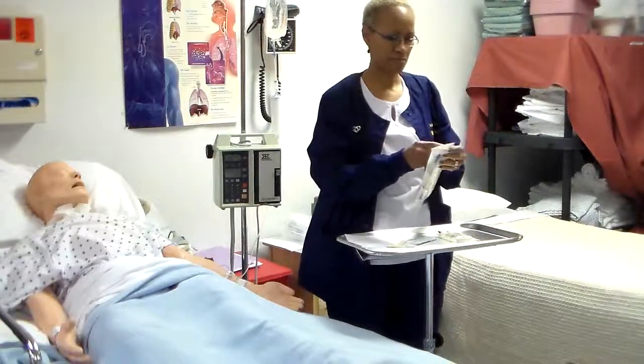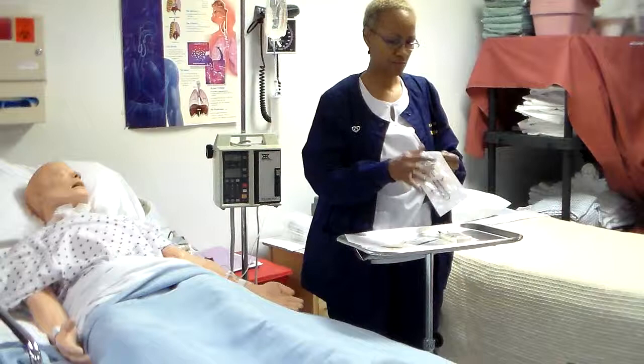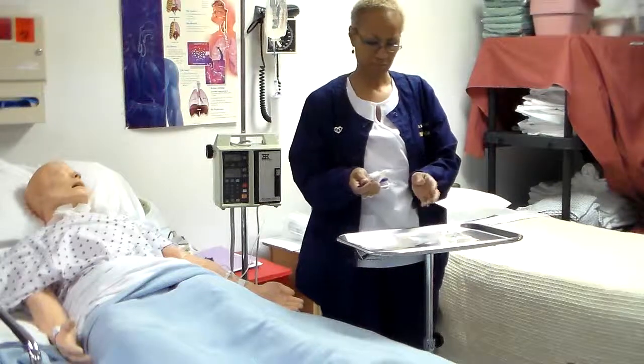Administer infusion. Piggyback or tandem infusion. Connect infusion tubing to medication bag. Allow solution to fill tubing by opening regulator flow clamp.